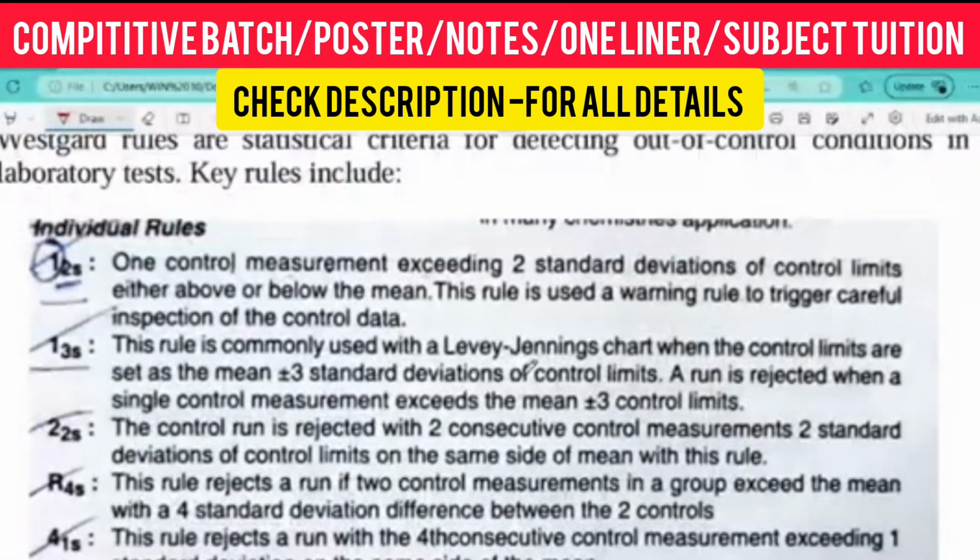Now we are understanding these rules. Say me, up to this much understood? Yes, sir. Okay. Now I am explaining a very important topic in this methodology, and if you understand it, you will not face any doubt regarding quality control. That is the Westgard rules. Have you heard this term? In Pallab Basu's book the Westgard rules are mentioned. Not only that book, every book mentions the Westgard rules, because the application of Levy-Jennings charts is defined by the Westgard rules.